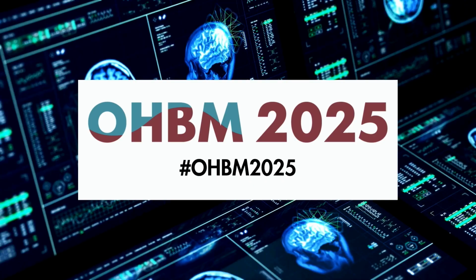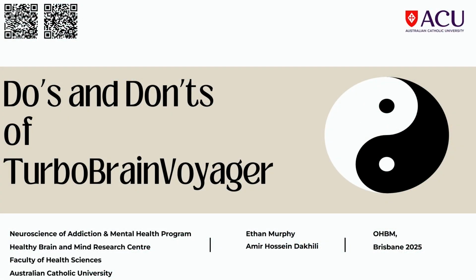Yeah, so I think this is a good way to show as well, a lot of what's gone before has shown how complicated neurofeedback can be and how many systems are in place and how many places it can go wrong. So this is really a collection of myself and Amir's best hits in terms of mistakes that we've made. We thought we've a participant in and everything's going well and then we do something stupid. So yeah, I think Amir, if you want to start the first one.